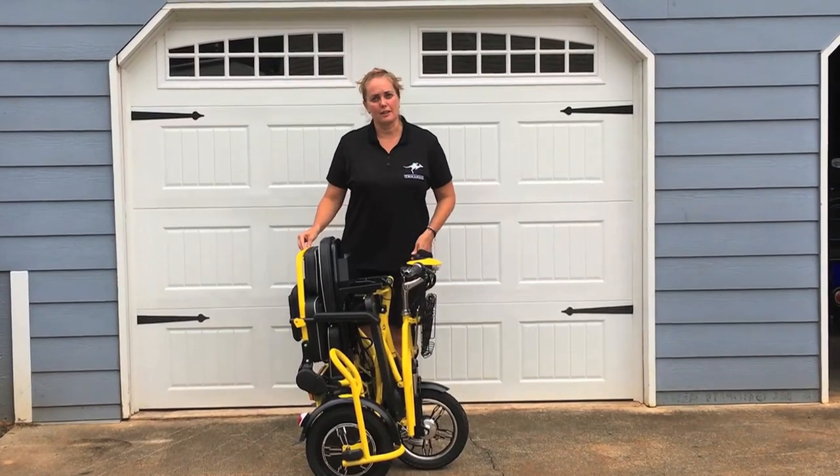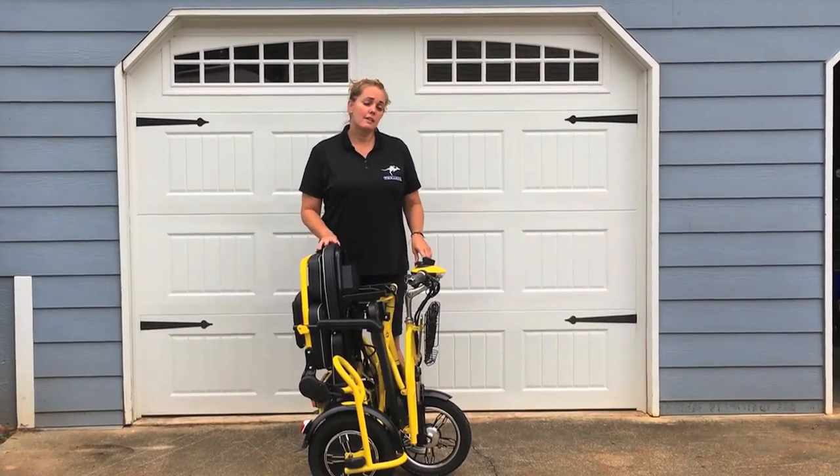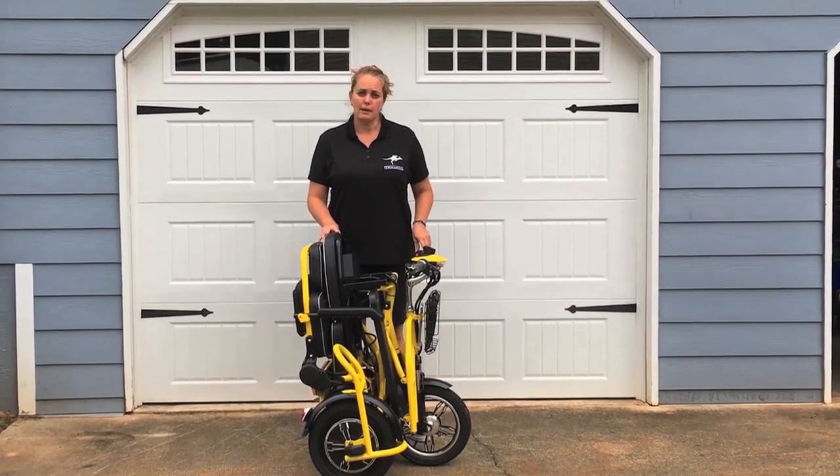This is the Trachoroo Flyer XL. It has a lithium battery and weighs 140 pounds.